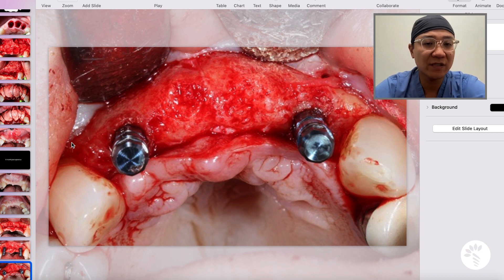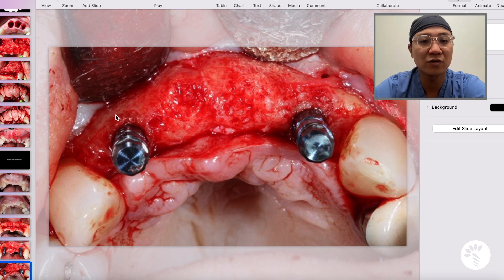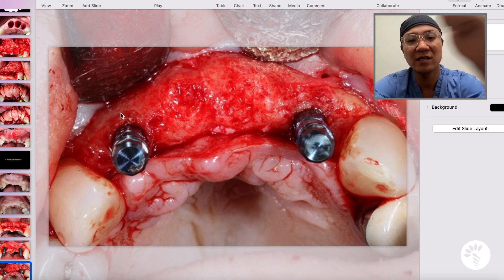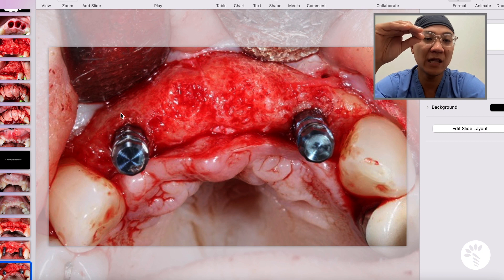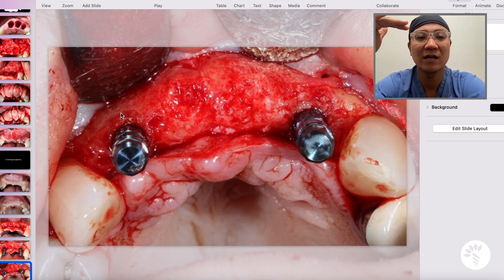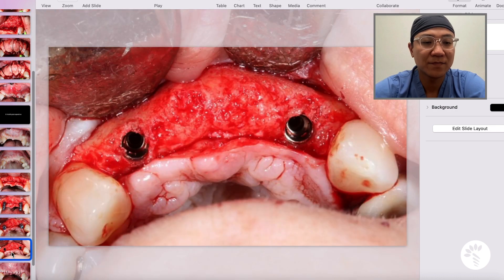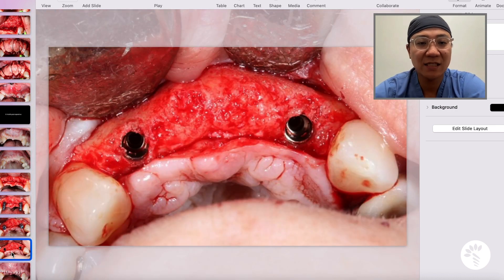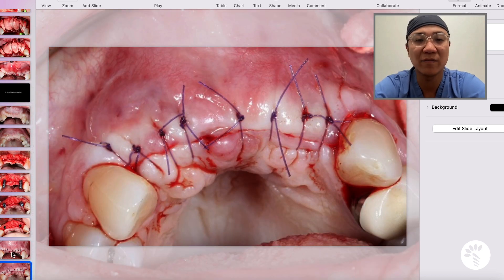Don't forget, as I previously mentioned, you always want to leave at least two millimeters of bone buccal to the fixture. The implant needs to go as palatal as possible, because when you have less than two millimeters of buccal bone to the fixture, the implants are going to experience the risk of recession. After placing the implants, this is how it looks — without the mount fixture — and primary closure was achieved over the implants. The implants will be further submerged for osseous healing.